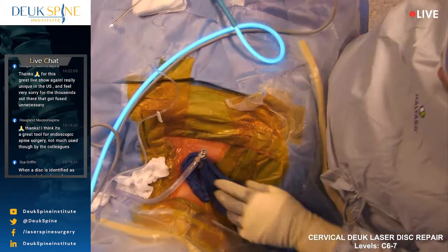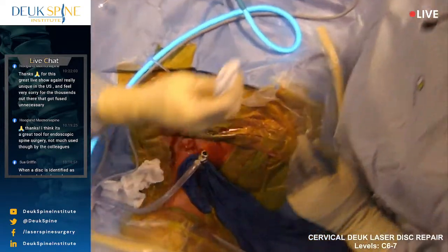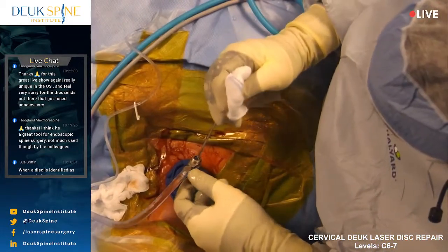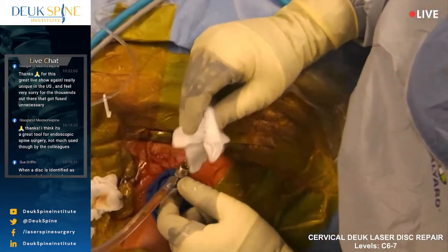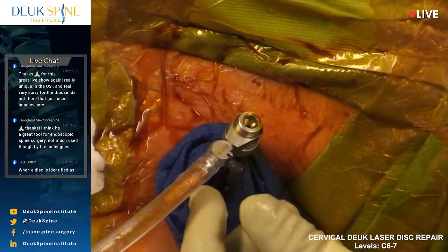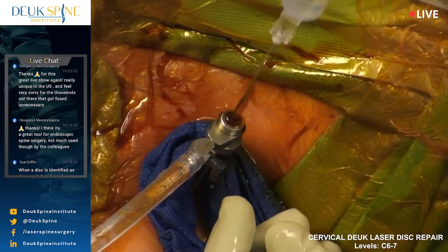This was a tough one because the access was difficult, getting down to the actual disc because of his very thick shoulders and high collarbone. But we were able to do it through a modified technique of crawling along the front of the spine with the tip of the dilator.